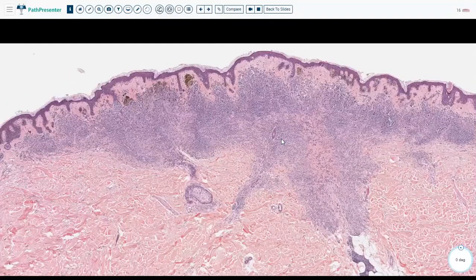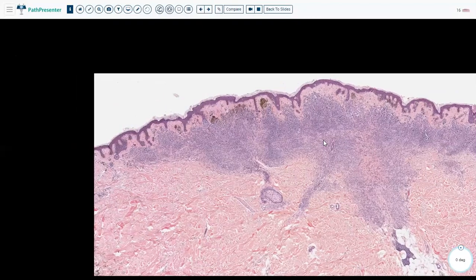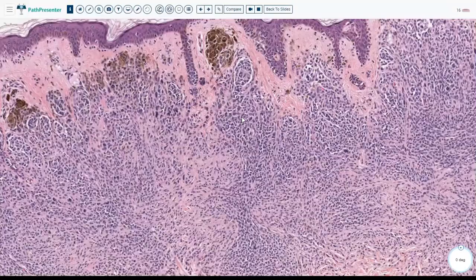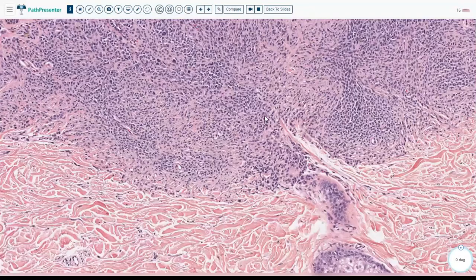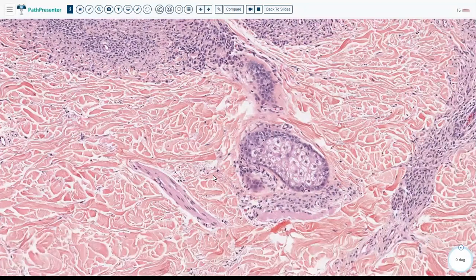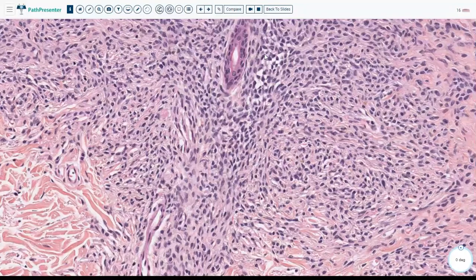Congenital nevus, yes. Congenital nevi are very large, and obviously when you see them clinically, they're very large. So histologically, they should be very large. They have specific features, like, at the top, they look like normal nevi, with nests that start to scatter about when they go deeper. But there are other features that you don't usually find in normal nevi, which is interstitial spread into the dermis, and its tendency to go around the neurovascular and adnexal structures, like here. See, this is part of the hair follicle, so it's going around the sebaceous gland. And you can see also here, it's going around this eccrine duct.